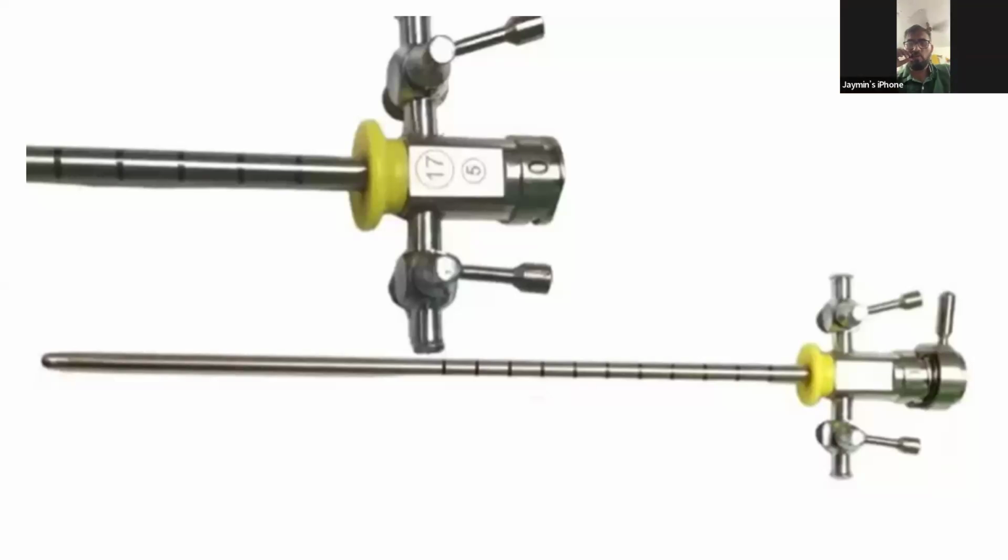No, sir, it can be used even for male cystoscopy and male stenting. The only problem is the size with the 17 French sheath, so a maximum of 5 French could be accommodated. Okay, you mean the instrument channel is 5 French? 5 French, yes, sir. Okay, so how will that make a difference between male and female?